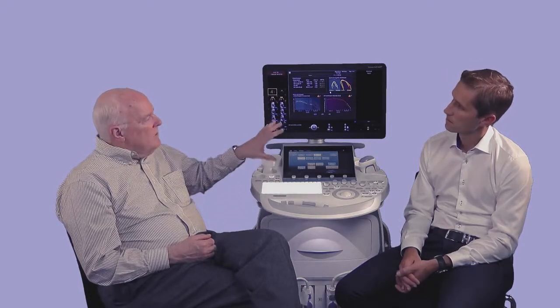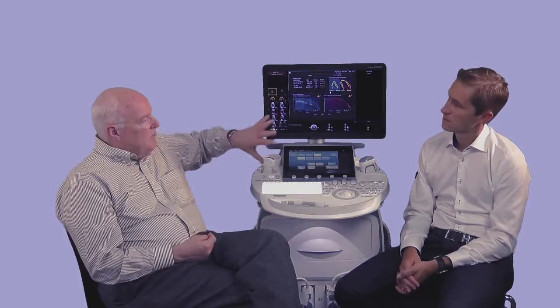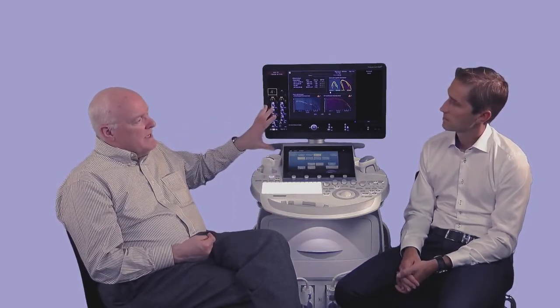And so with this concept, there are two important principles. One is I only have to make 6 measurements, very simple measurements to do. I get a lot of information. So the four-chamber view is easy to acquire. That's number one. Number two, I make 6 simple measurements, and I get lots of information about size, shape, and function, the 4 chambers and the ventricles.